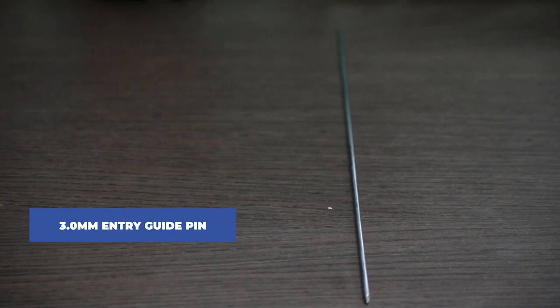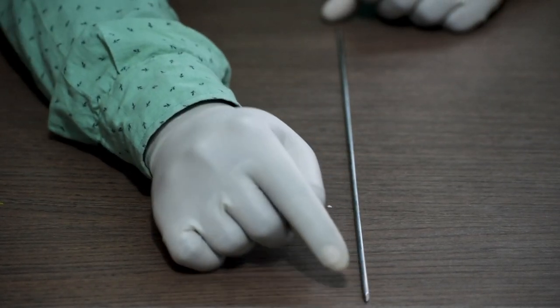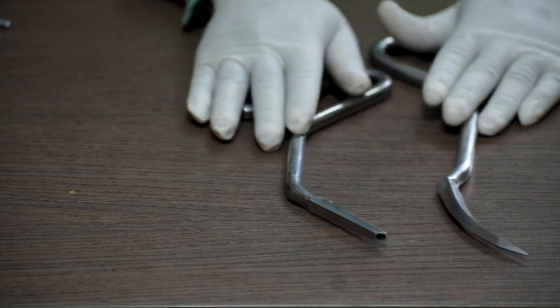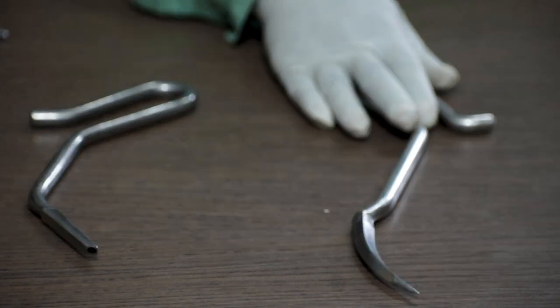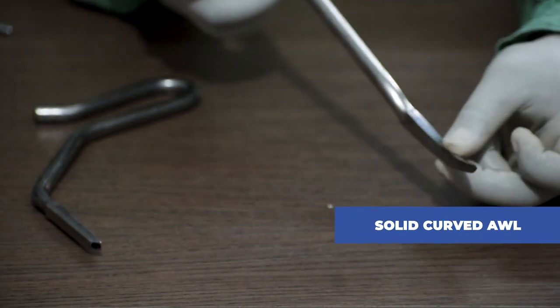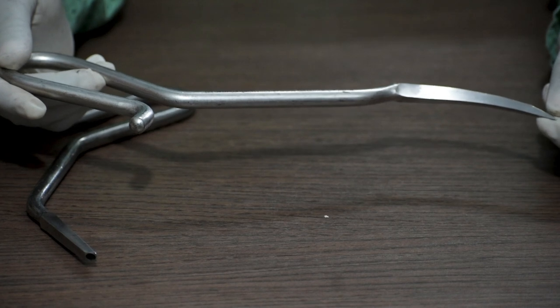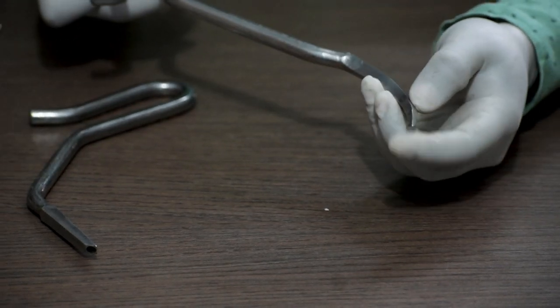Now let us check out the instruments. This is a 3 mm entry guide pin, used to create the entry point. The diameter is 3 mm and the length is 390 mm. Up next is the awl. This is a solid curved awl — as you can see, it has a curvature and a diamond-pointed tip, used to create the entry point for the nail.